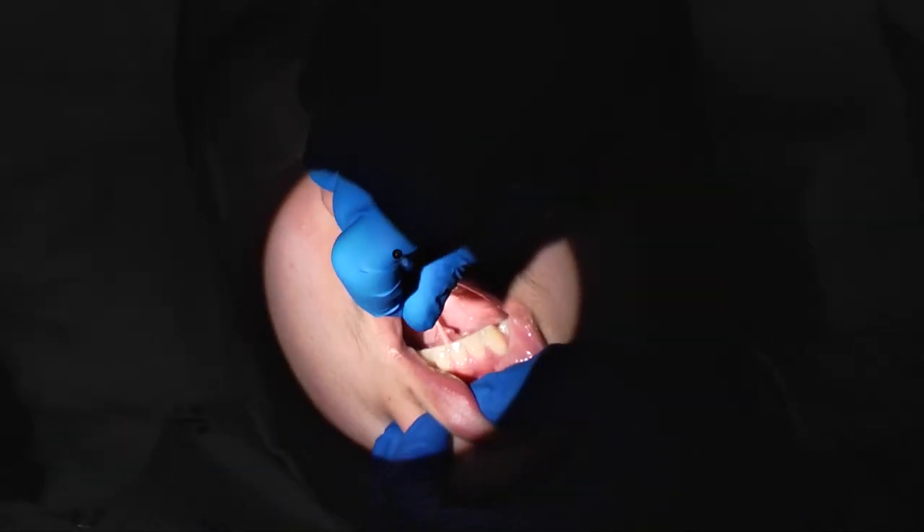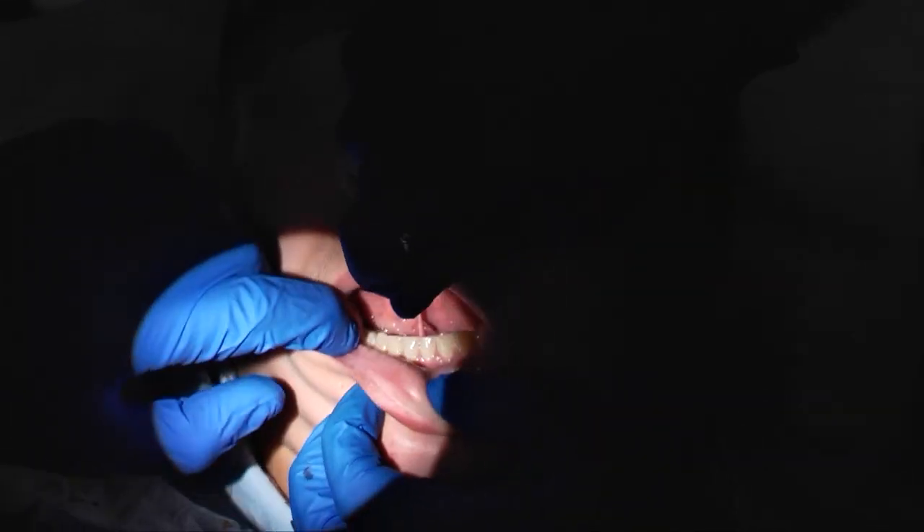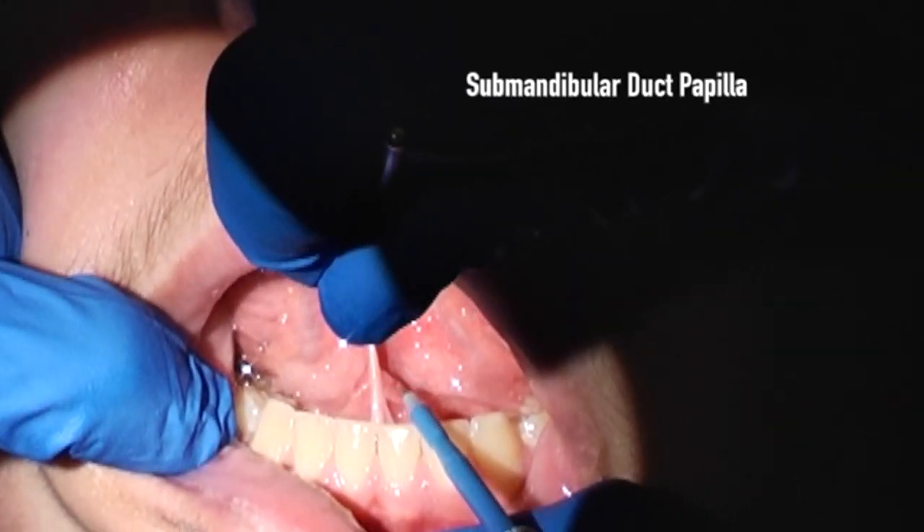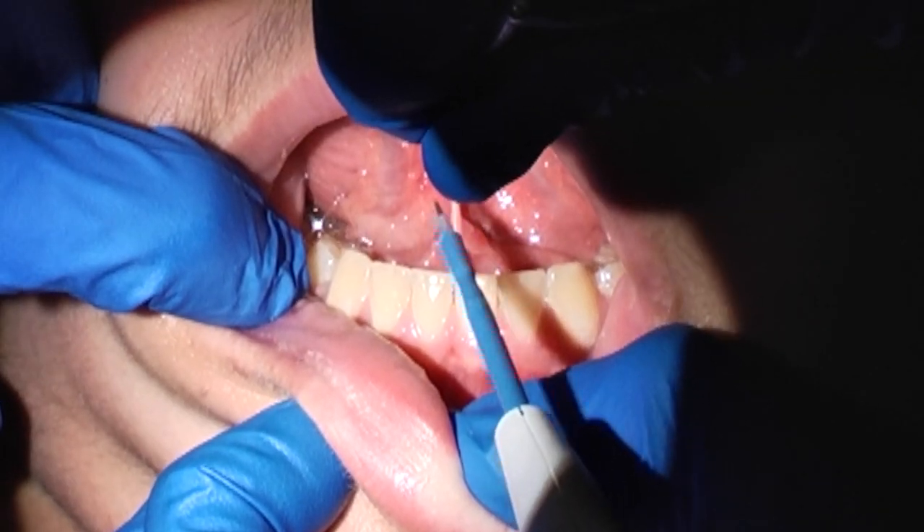Here we see a finger grasping the tongue and the elevator then being placed. The tongue is elevated and you're able to see the frenulum under tension. The bovie is pointing to the submandibular duct papillae and the frenulum there.